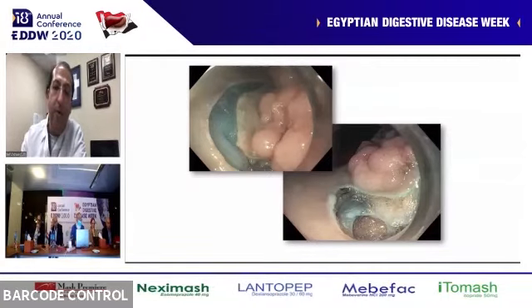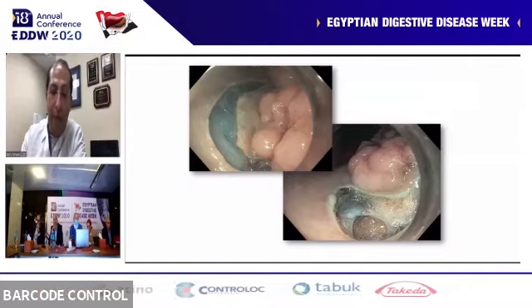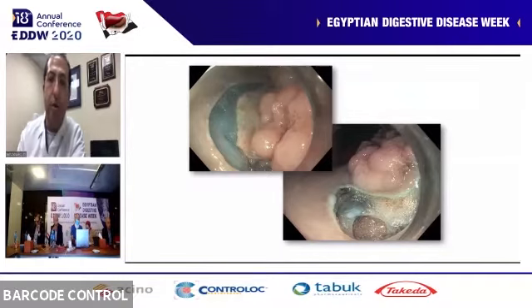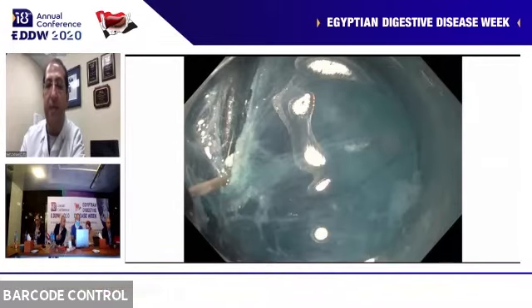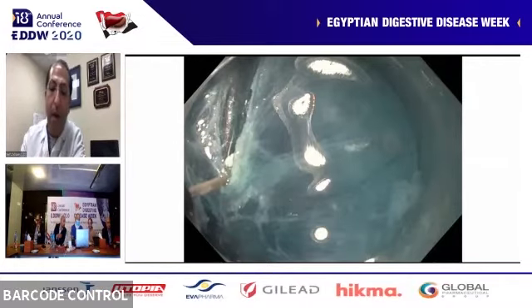But when you do third space endoscopy, this is something that you may see and you get comfortable with, as long as you understand your plane, you do it safely, you use CO2, you understand how to address this at the end of the procedure, and you do not compromise the patient safety. This is again third space, the space of the submucosa, putting in a knife into the submucosal space to create resection.